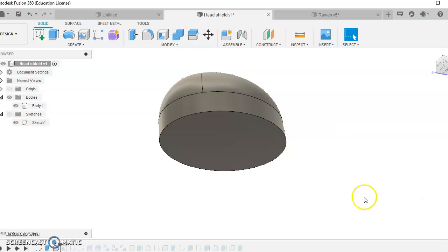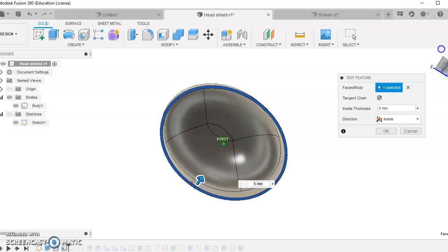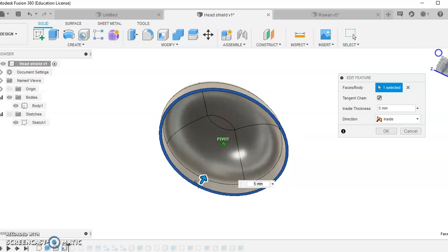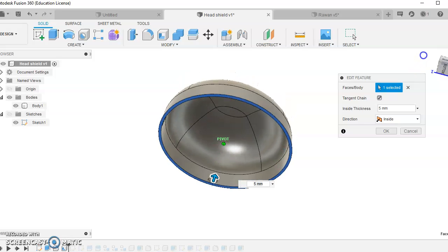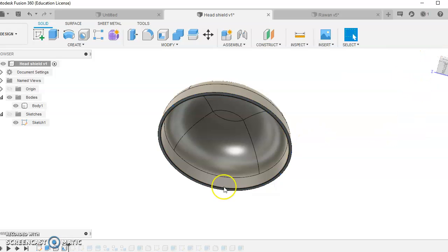Anyway, that's done. So the next stage is to look at the shell feature. So if I go to Edit Shell, what you've got here, you'd select the face, and then the wall thickness of the helmet would be about 5 millimeters. And the one that we analysed in the classroom at school was about 4 millimeters. So I've gone for 5, and you just shell the inside of the item, and it looked something like that. Okay, so once you've got the shell done, you then go to the next stage.